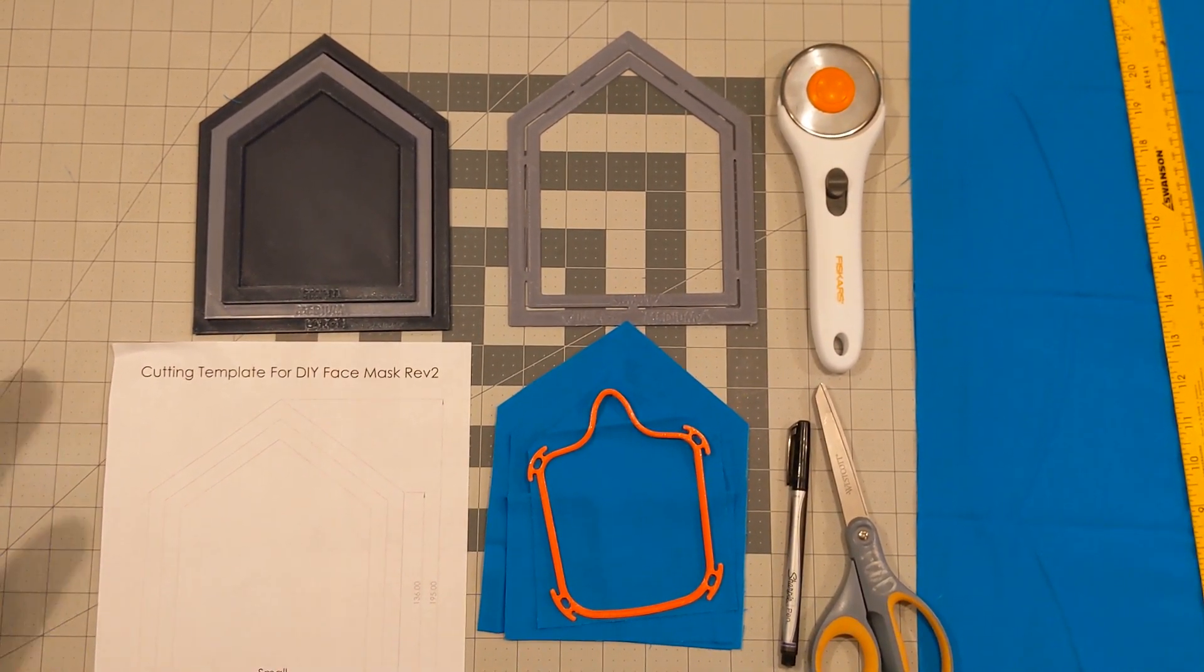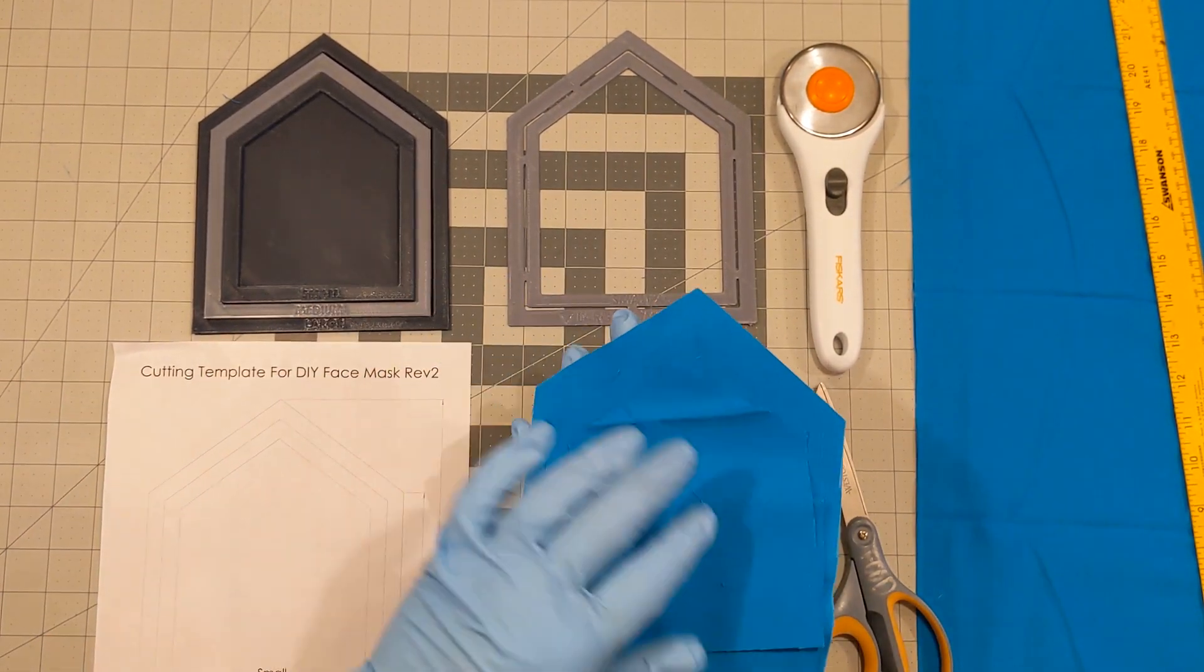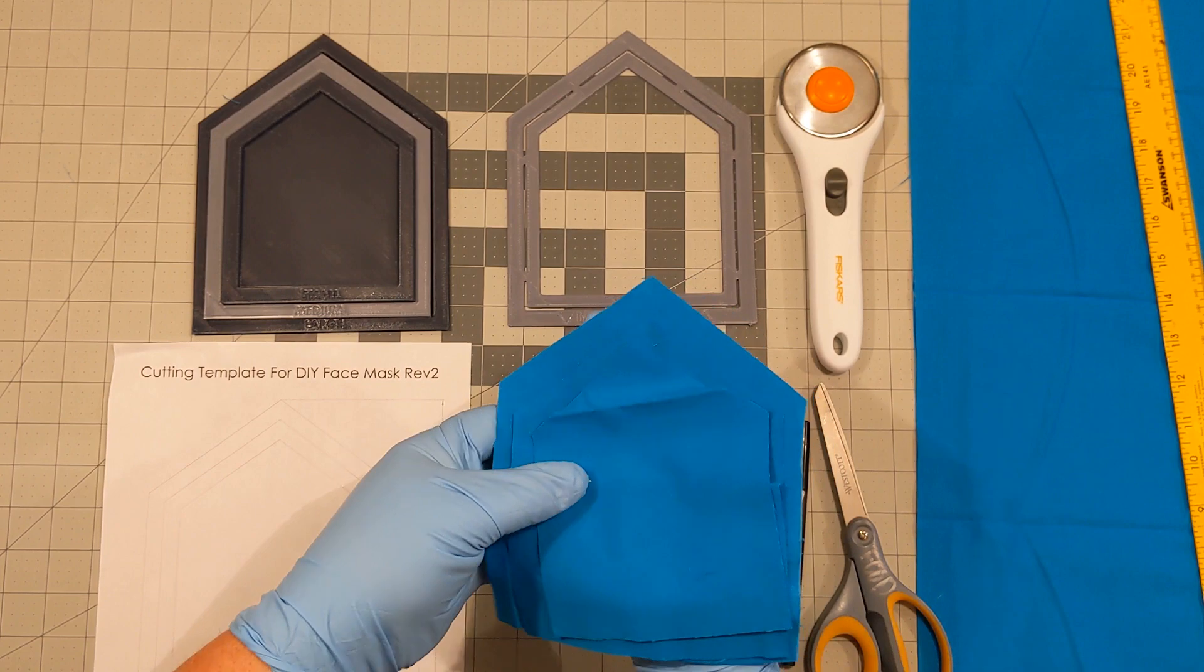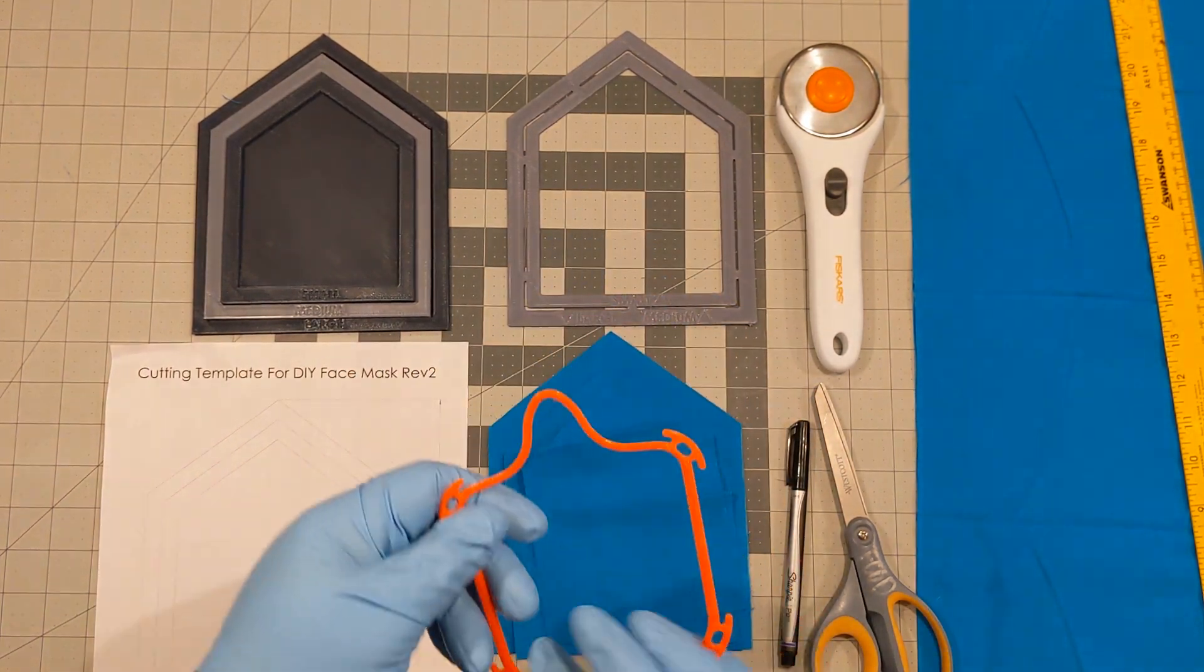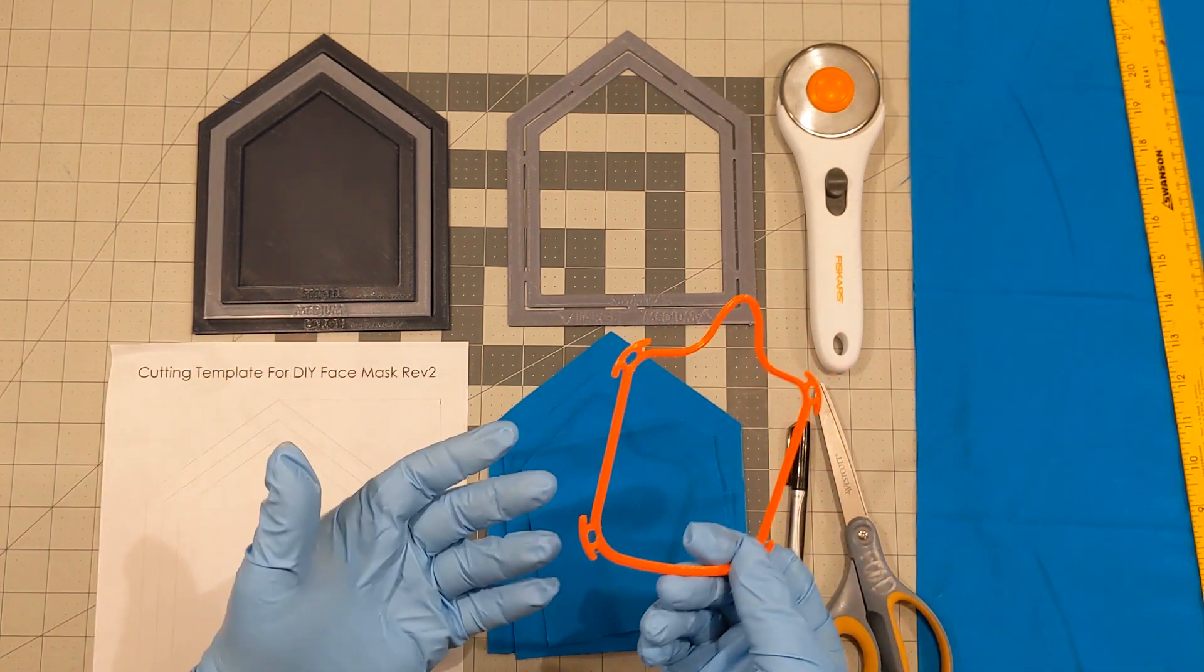Hey everybody, Mark here and I want to make a quick tutorial on how to cut out your filter material for your community face mask frames. Let's get started. You've printed out your frames and now you want to cut out your material. So what do you do next?